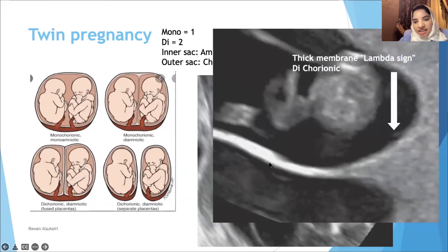The really thick membrane that looks like lambda — the lambda sign between the two babies — immediately tells you this is dichorionic diamniotic, because it's lambda.